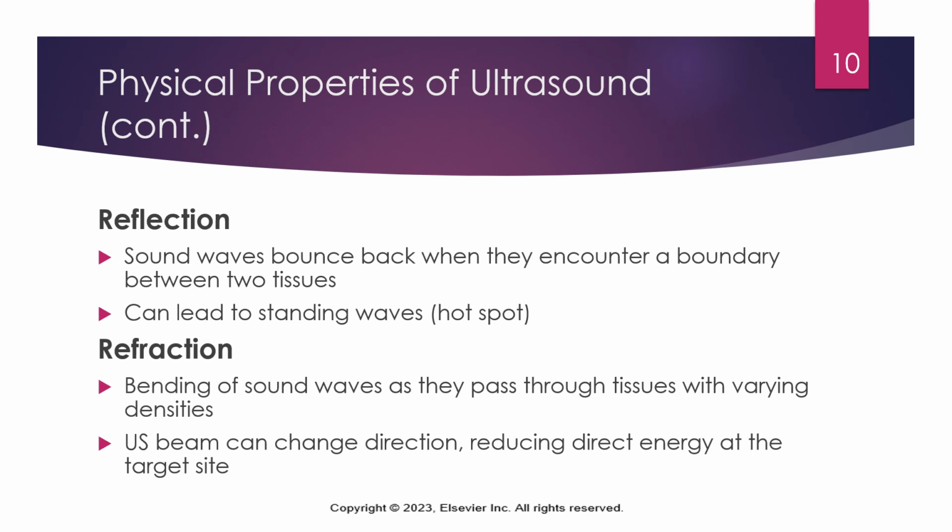When it bounces back, this can create what we call standing waves, which are basically just concentrated energy that can cause hotspots. So this is what could lead to burning if we're not really careful and meticulous with the technique that we use. So we want to make sure to keep that sound head moving.